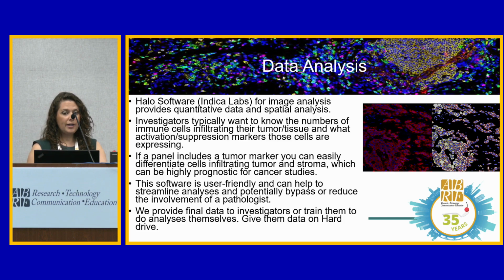It's also really high throughput, which is nice. It could generate data in a very fast way. We typically provide final data to investigators, but we also train investigators and students and postdocs on how to use the software. And finally, we'll give them the data on a hard drive.